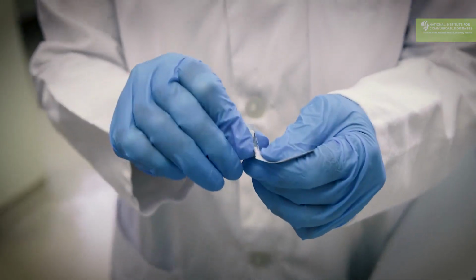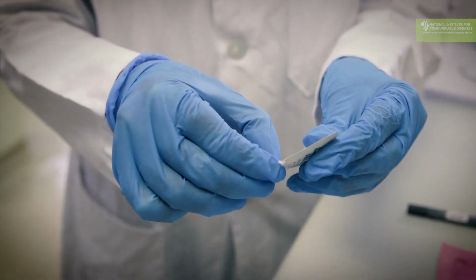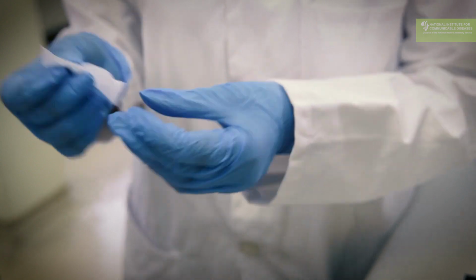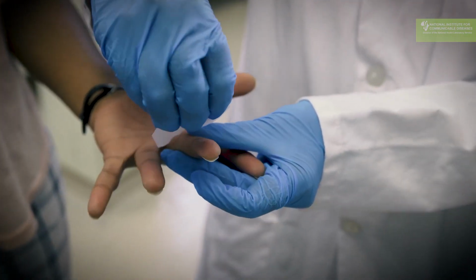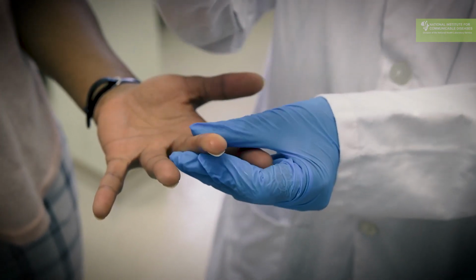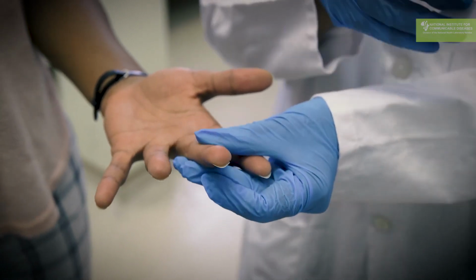Once you have selected the finger, you need to clean the finger. You use the alcohol swab to clean the finger. So you need to first tear open the alcohol swab. You get the hand, and you're going to move from the mid finger in one swoop over to the fingertip to make sure that you have cleaned the finger. You let the finger dry, and then you are ready to start the test and get the lancet ready.